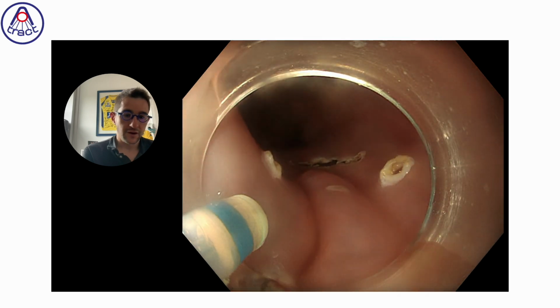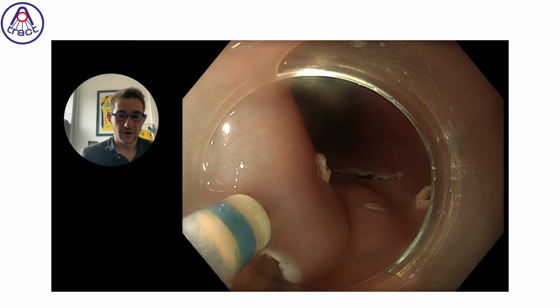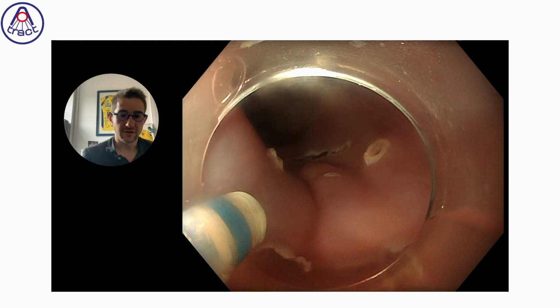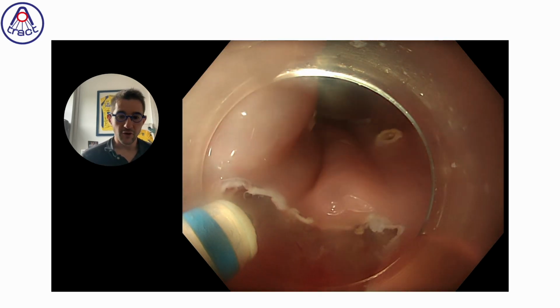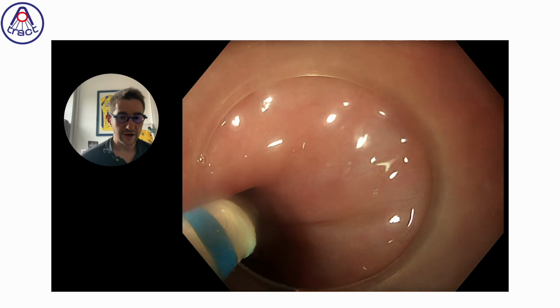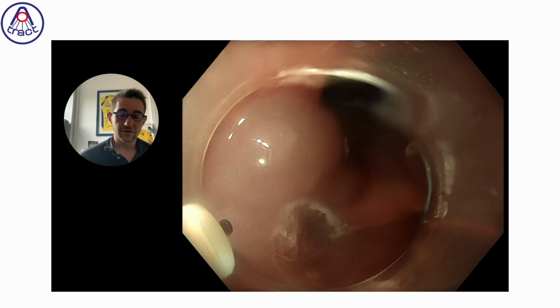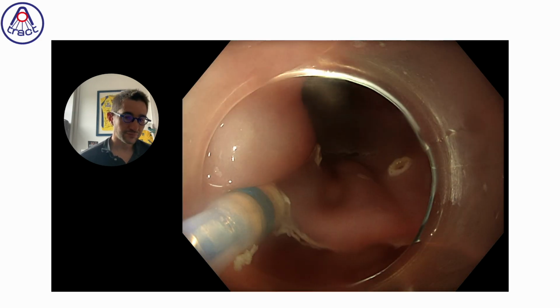Okay. Here I'm explaining to my fellow how to perform, and he will take the end under supervision. So that's why we stop the flow of the procedure, because I want to explain and make two dots to be sure he will have the good direction and not losing himself in the area.